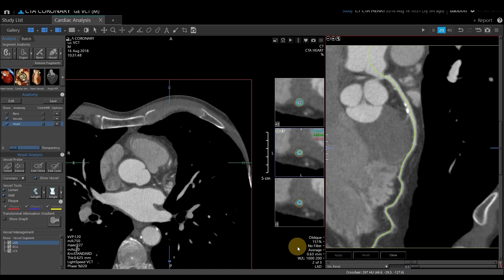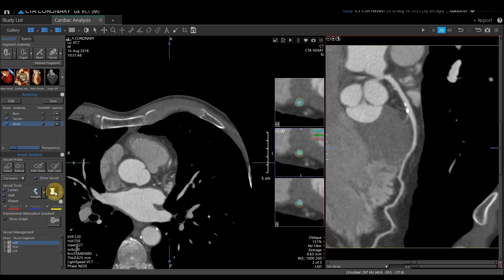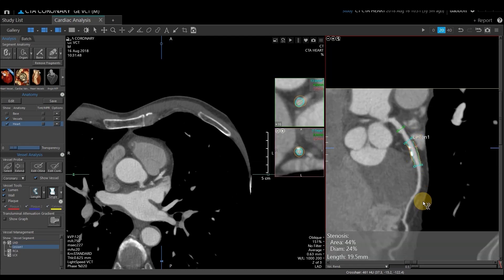Now I want to do a lesion analysis. Under the Vessel Analysis section, there is an option labeled Single — I'm going to select the Single tool. I'll come to my curved planar reformat, left-click and drag above and below those lesions. Vitrea is going to determine the narrowest slice between my beginning and end points and also give you a reference vessel for comparison. This reference vessel is set predetermined above where I begin my analysis.